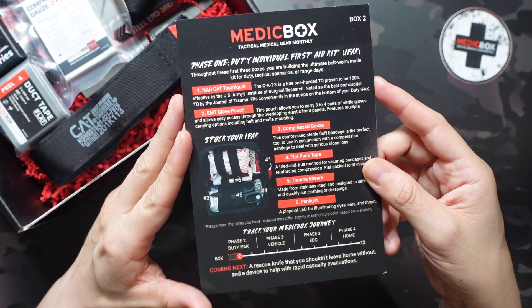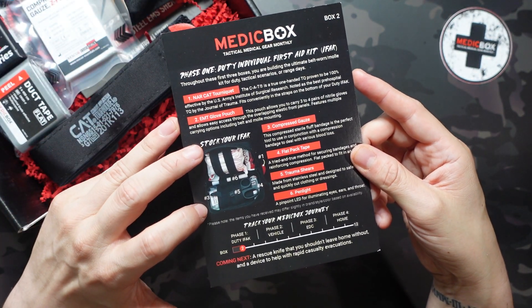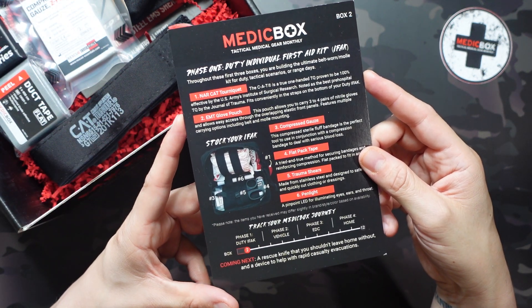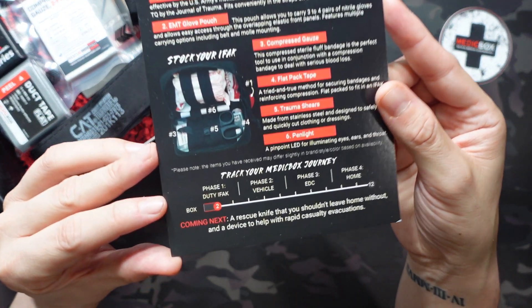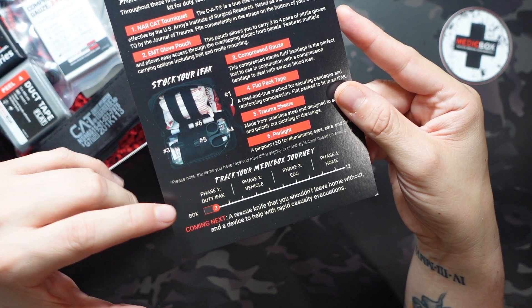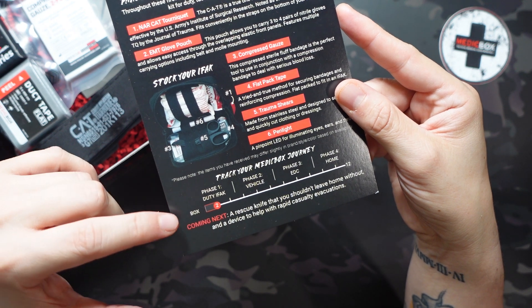We also have our content list. On the front we have our standard items; on the back we have our Pro items as well as information on this month's courses. At the bottom we have that Track Your Medic Box Journey section. As mentioned, it's in phases — we're in phase one, box two out of three, which is our duty IFAK.